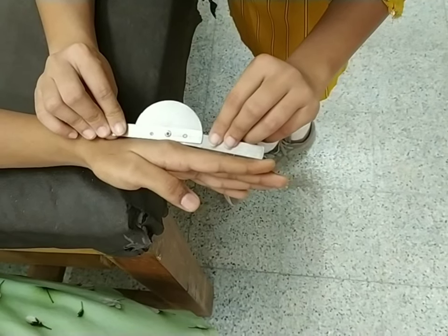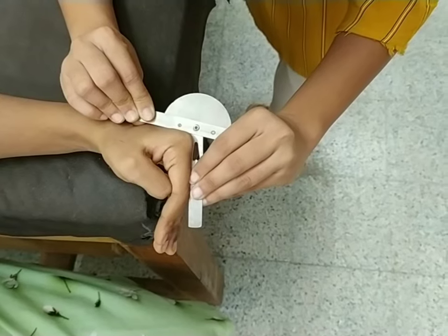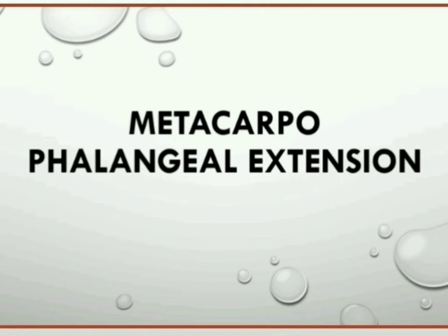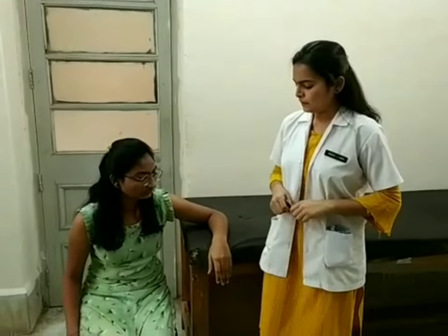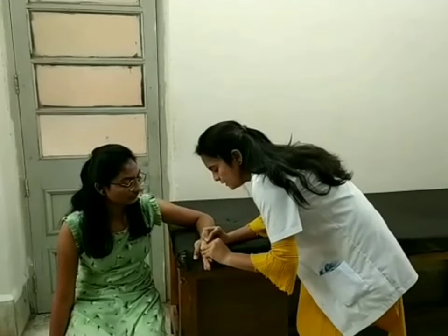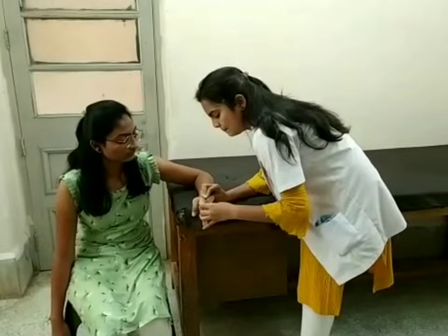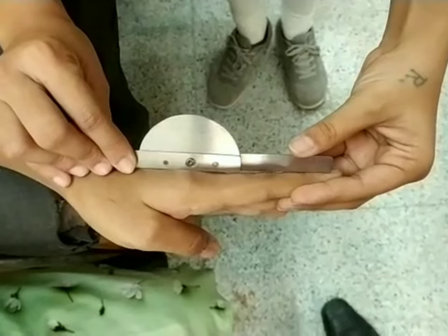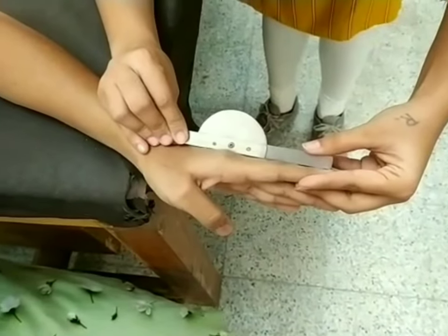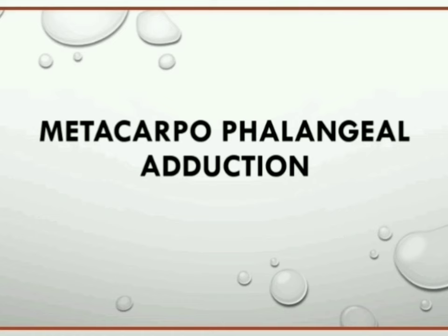Ask the patient to bend your finger towards your palm as much as you can. Normal range of metacarpophalangeal joint extension. Position of the patient sitting on a chair with forearm and palm fully resting on a supported surface in the palm-down position. Fulcrum over the dorsal aspect of the metacarpophalangeal joint. Normal range of metacarpophalangeal joint flexion is 0 to 90 degrees and extension is 0 to 45 degrees.